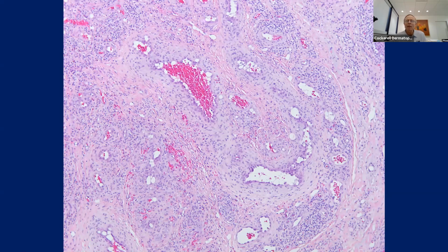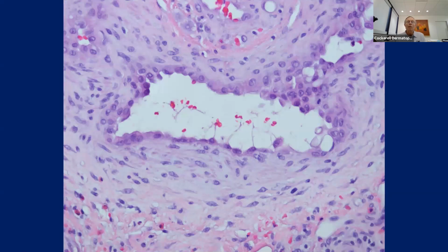You can see these are markedly thick-walled blood vessels with very, very large endothelial cells that are protruding into the lumen. And many of these endothelial cells have these vacuoles in their cytoplasm. Now, again, I don't know if anybody knows what that's called in the histology microscopically. If you want to put that in the chat room for an extra bonus question, you can do that. But notice the markedly thick-walled blood vessels, and also notice that there's some inflammation in the periphery. And anybody know what these cells are? Hopefully you can recognize those.